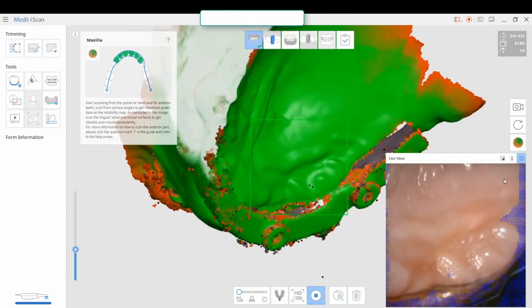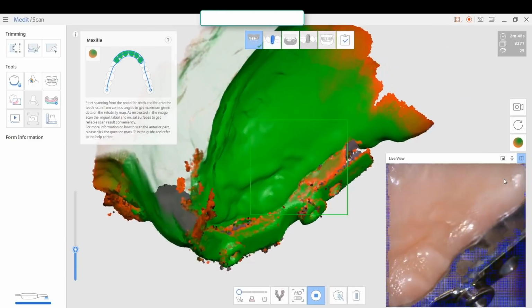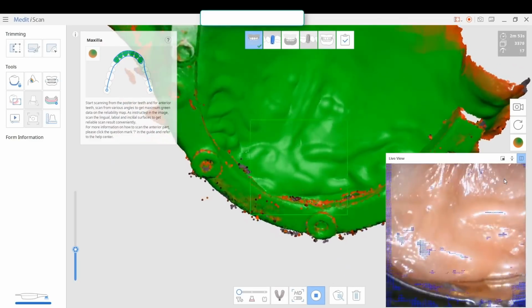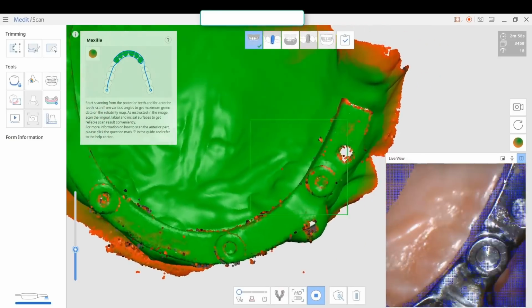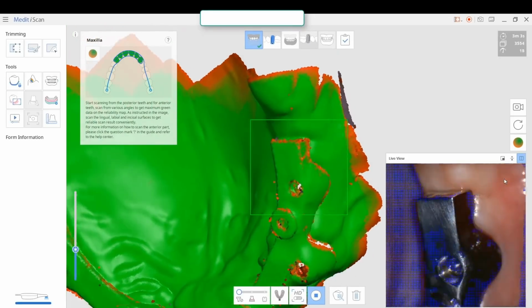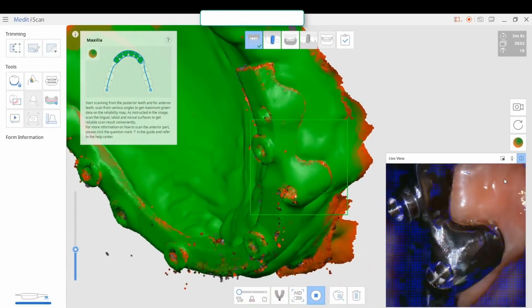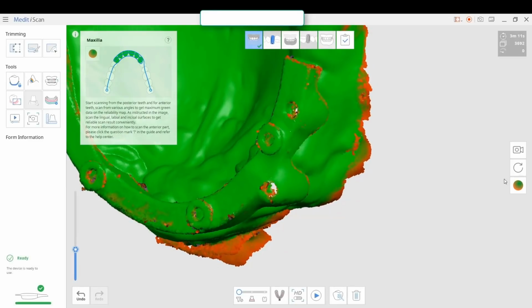Now, with the new software, I image the same case. There's a specific feature for scanning metal that you activate, and you'll see how much faster this is. But it's important that you understand the way I'm imaging, the focal length I have it set, and what dictates the pace I image with. It's about 3 minutes so far into this, and you can keep angling it to fill in every area that has deficient data if you wanted to, for whatever particular reason. So now we'll process this and we'll try it out with the beta software.